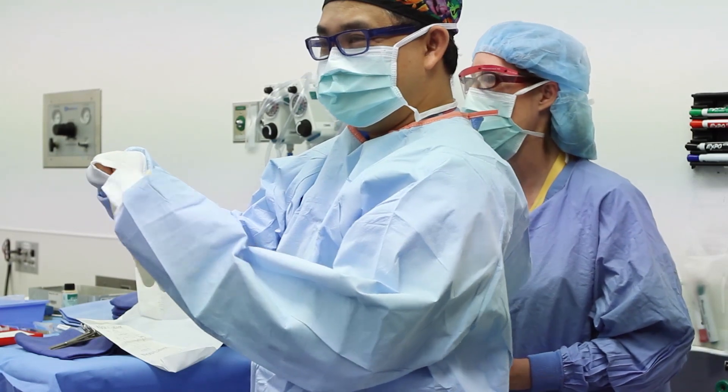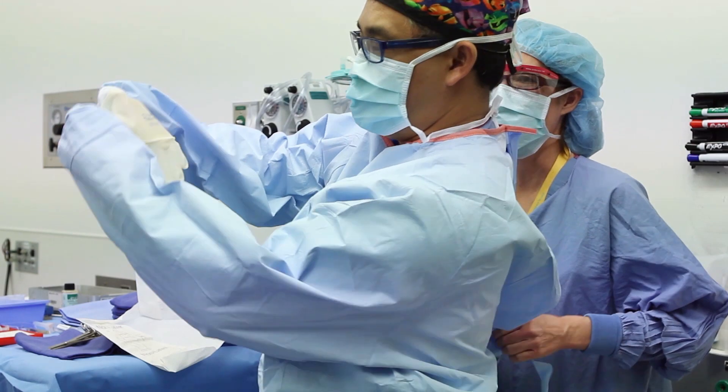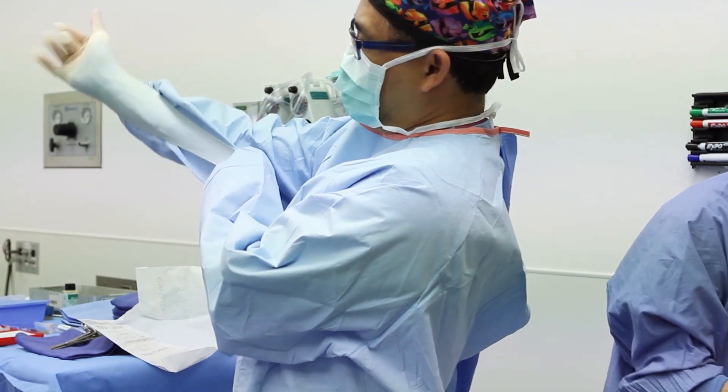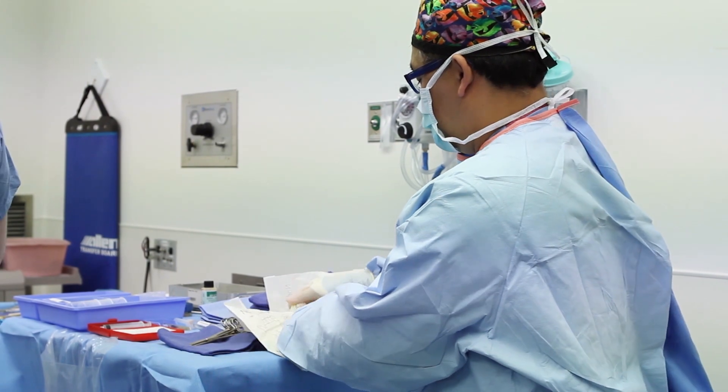We again demonstrate the technique of gloving without assistance. It is important to remember to keep the hands and forearm within the sleeve of the gown until the glove can be placed over the cuff. Once accomplished, the hands are then brought through the glove without contacting the outside surface with the hands.